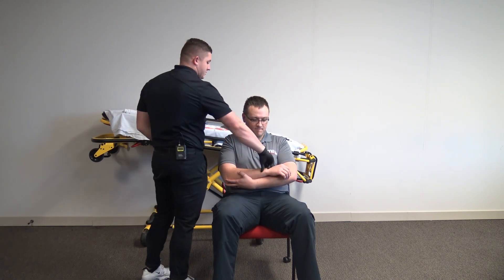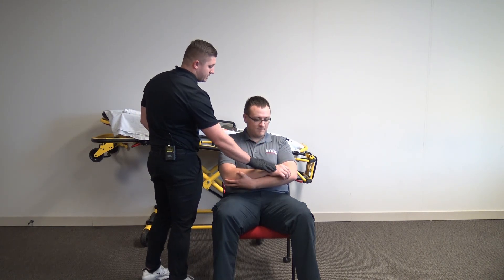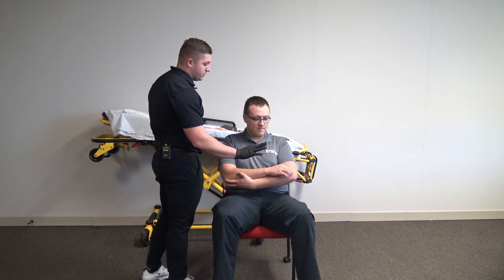Now I'm going to go ahead and check CMS. Circulation — I feel a pulse. Sensory — can you feel me touching? Awesome. And motor — can you wiggle your fingers? Perfect. I'm going to put a splint on that arm. I'm going to use a SAM splint.